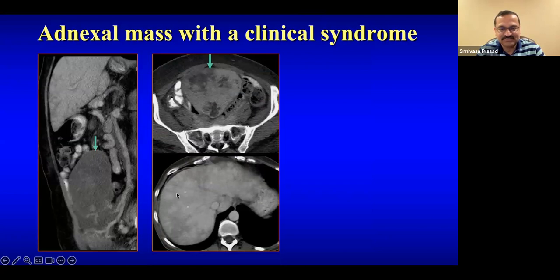And this was an interesting patient who presented with carcinoid heart syndrome, and the primary was in the ovary, a heterogeneously enhancing solid mass in the midline, which turned out to be referred to as a uterine leiomyoma, because it was considered midline and probably connected to the uterus.